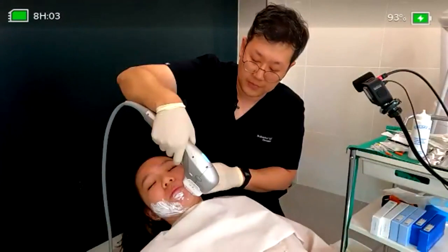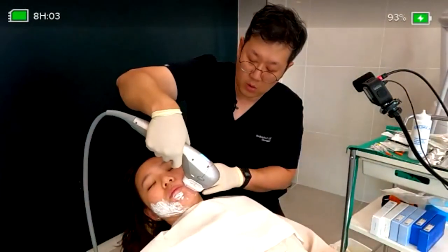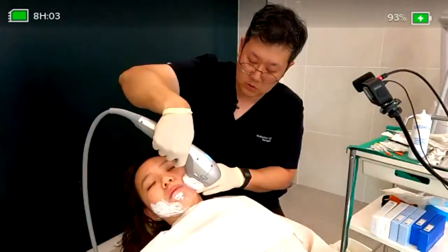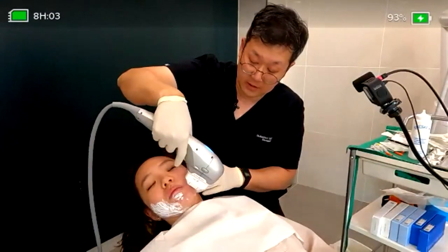Usually, there are two approaches: using the smaller energies and more passes, or using the higher energy with a smaller number of passes.